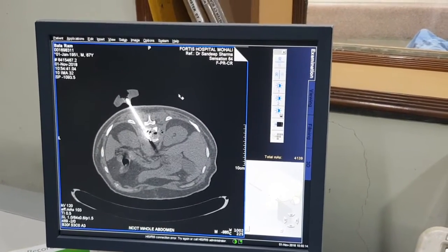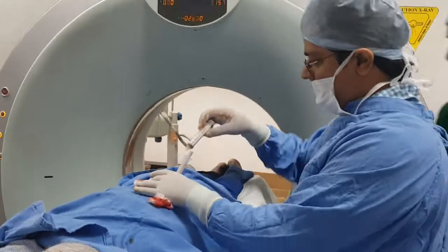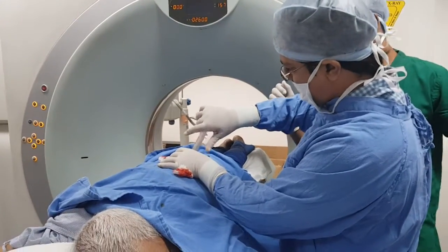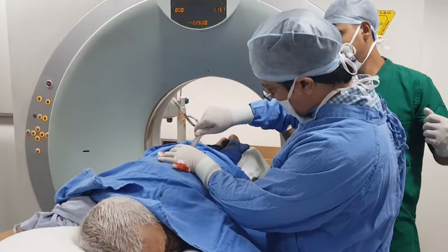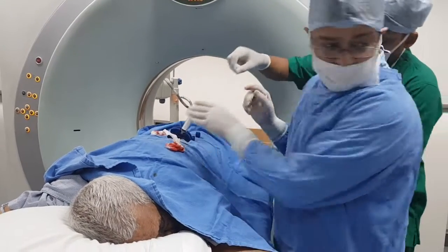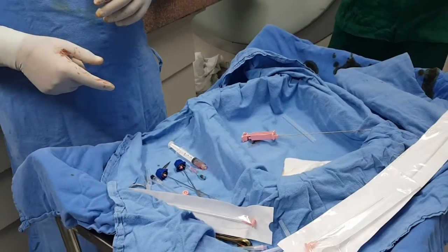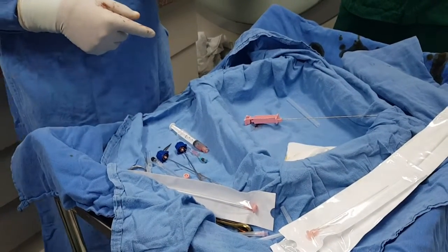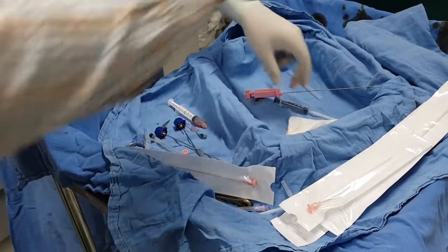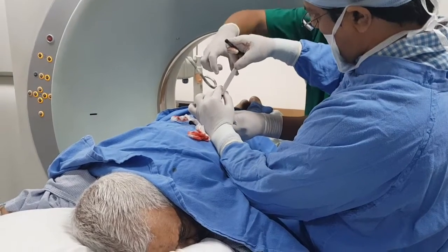Here is the first one and the second one. Okay. Now we will be on the job. Keep going — one by one. We have a 2cc piston. So what we are doing — I am putting it in.